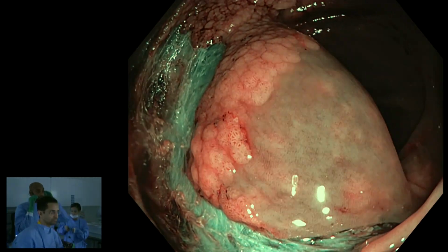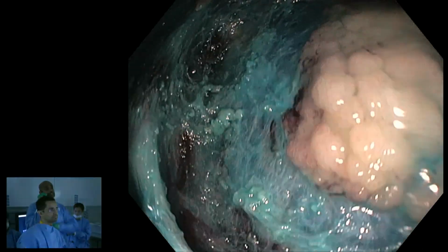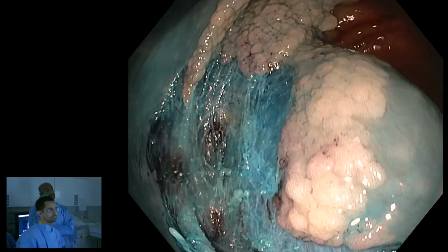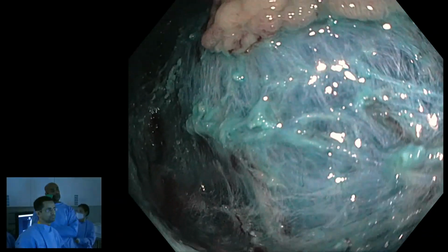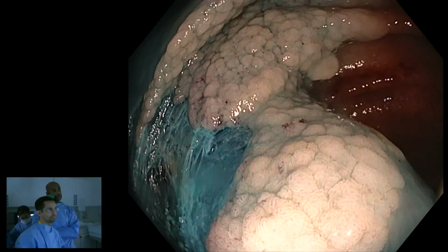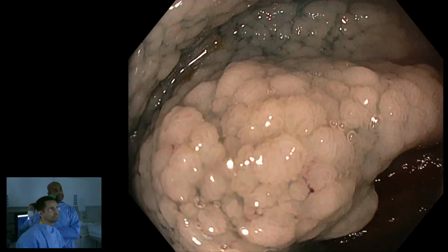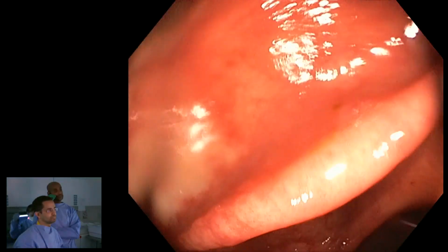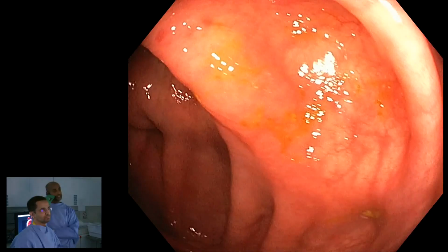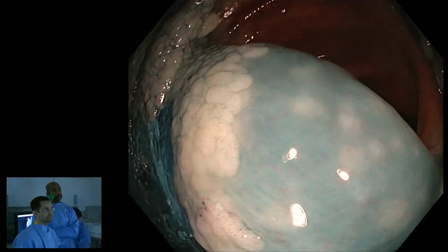So this lesion that Majid is doing a great job on is the classic lesion for wide field EMR. It's a Paris 2A flat lesion with a granular morphology, and it's in the proximal colon, in the mid-ascending colon. It's probably around 50 to 60 millimeters. It goes across two folds, half circumferential. So this is the perfect lesion for piecemeal EMR.